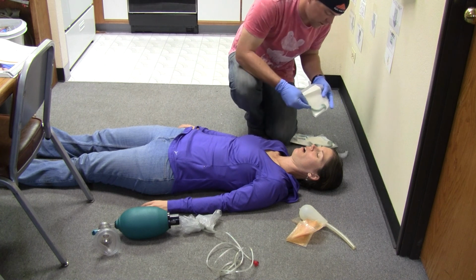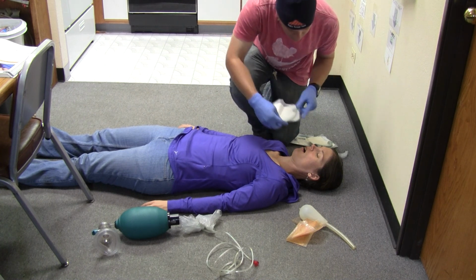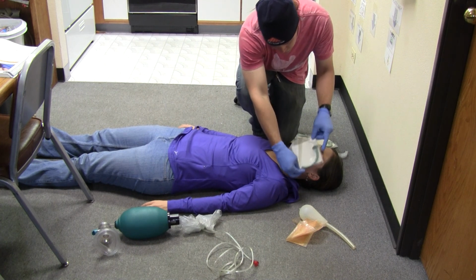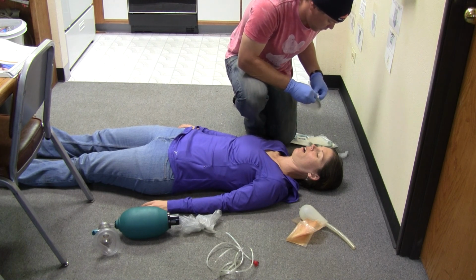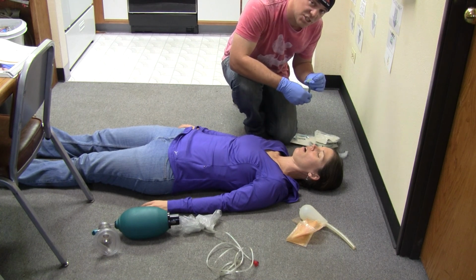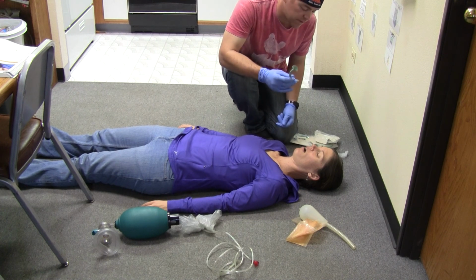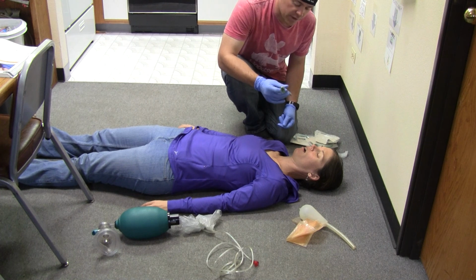With an NPA right here, you size these from the nose to the back of the jaw, just like that. Do not use an NPA if the patient has some type of traumatic head injury where you suspect a facial fracture or skull fracture, but these can be used on patients that have a gag reflex.